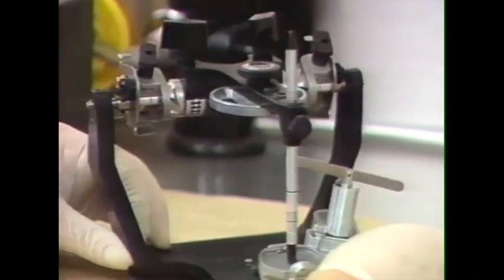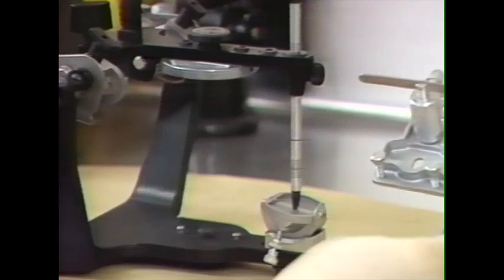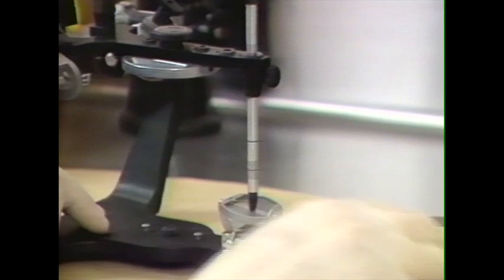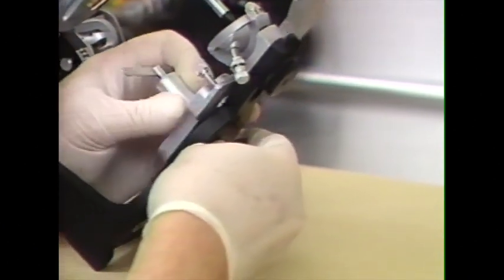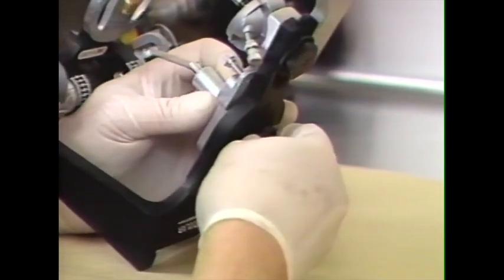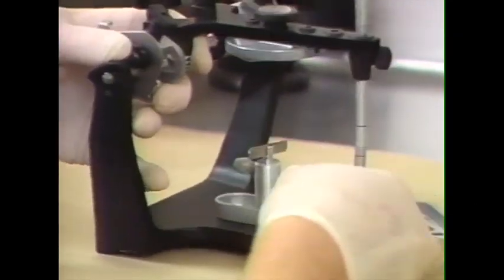To mount the casts, we're going to use the mounting platform, which has a built-in cast support. With this particular mounting platform, it's not necessary to remove the incisal guide table for mounting the Facebow record. The mounting platform is placed into position just as a mounting ring would be placed into position on the mandibular frame. Tightened securely.